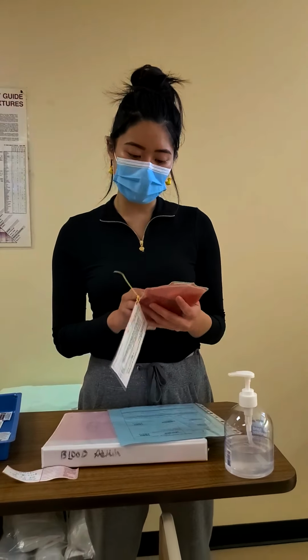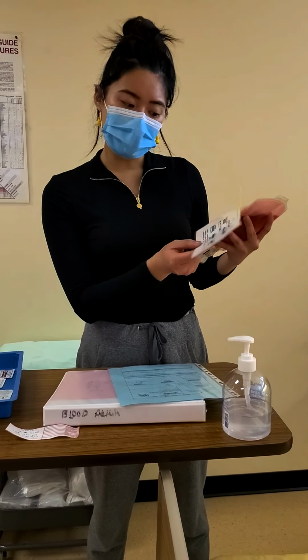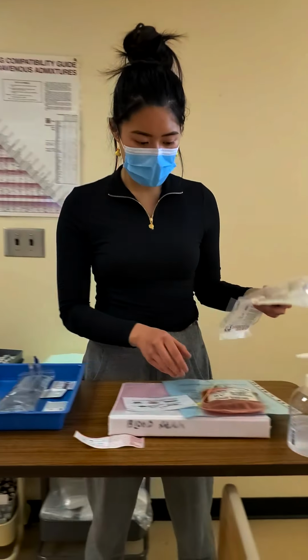Now we can take a look for expiration of this. And I see that it's not expired, the cross match is not expired, there's no leakage, no discoloration, no clotting, so it looks good to use. Right, so I'm going to just bring in my supplies with me.